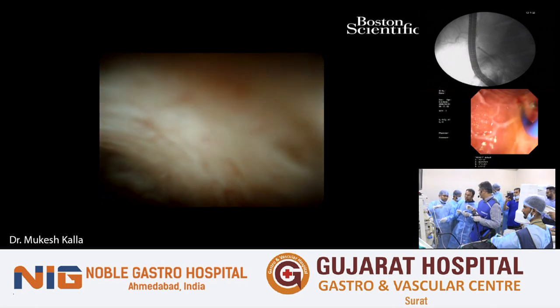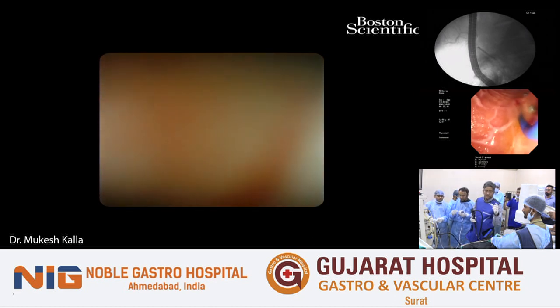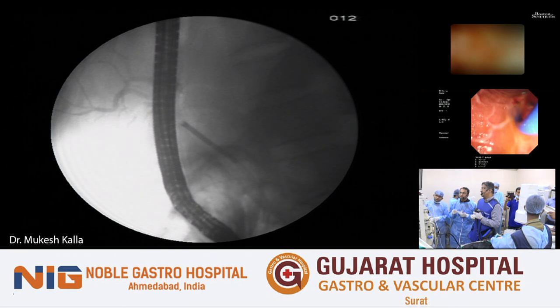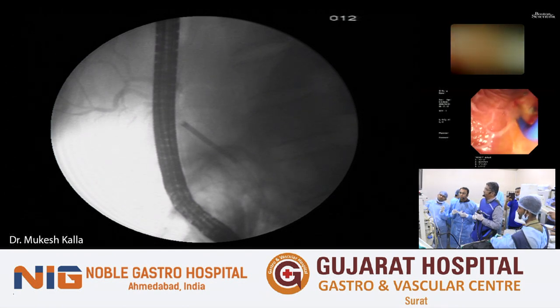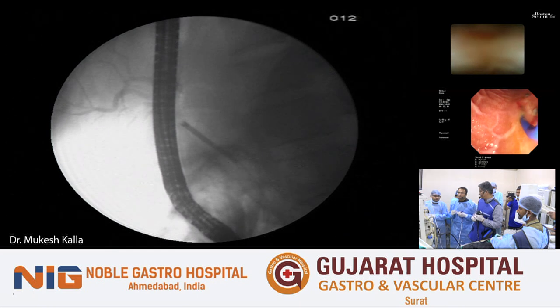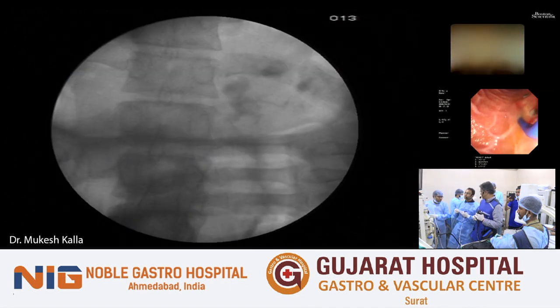You are finding it difficult? Now this is a challenge. Show the floor, please. So what happens is that when you are on a curve, taking the accessory out of the 1.2 mm channel of the cholangioscope is a problem. So I will straighten up the cholangioscope. Show the cholangioscope please. Now take it out. Now I have straightened up the cholangioscope. I hope this will facilitate easy movement of the, do it, oh, it's not coming.